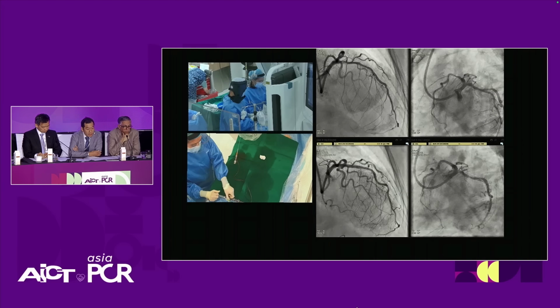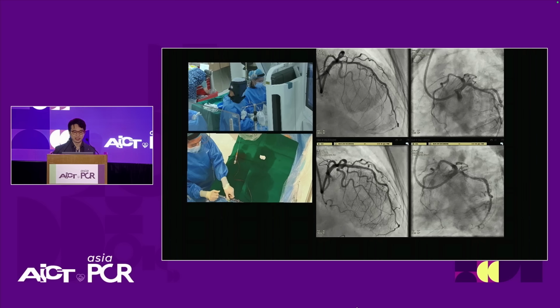Yeah. So maybe Mark, one final takeaway from your case that you want to share with the audience before we close this section. Yeah, I think DCB is a viable strategy with sufficient trial evidence showing good long-term outcomes, especially for patients with diffuse disease. Very importantly, adequate lesion prep, as we have explained today.